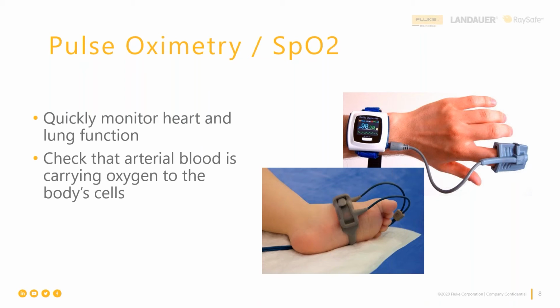Interestingly enough, one of the first places pulse oximetry was typically measured in the clinical situation in the hospital was using an ear oximeter. This oximeter was like an earring. It clipped to the bottom of the earlobe because there's pulsatile arterial blood flow there. It was used by respiratory therapy to assess and give an estimate of perfusion, just an estimate.